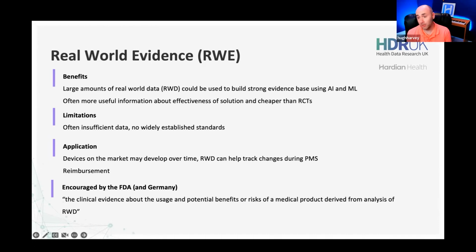Well, we all know in the real world, corrupted inputs are everywhere. Your CT scanner could glitch out, your ECG lead could drop off halfway through a trace, your wearable could become loose on someone's wrist. So there's all sorts of reasons to collect real world evidence, because the real world is messy, much messier than collated data sets. And so it is seen as the gold standard. And ideally, if you've done your clinical investigation appropriately, you will have used real world evidence in that, but you absolutely should be using real world evidence in your post-market clinical follow-up studies.